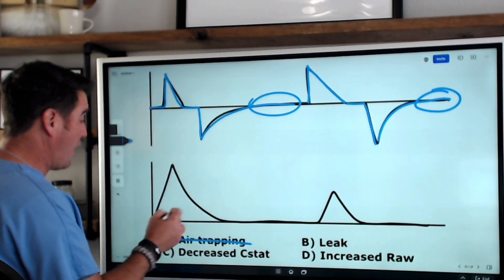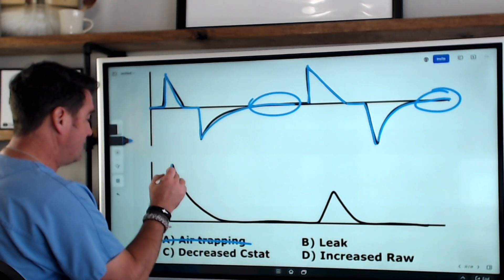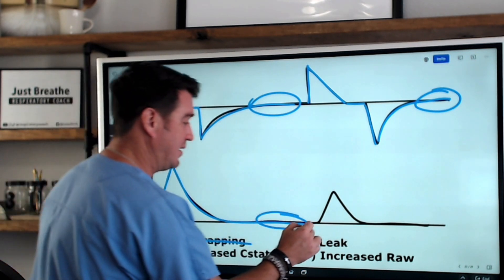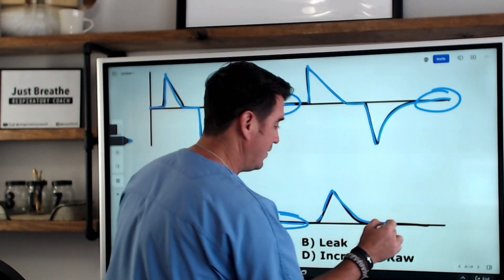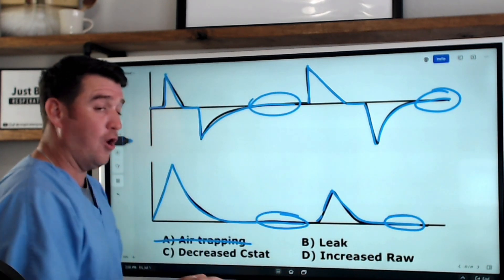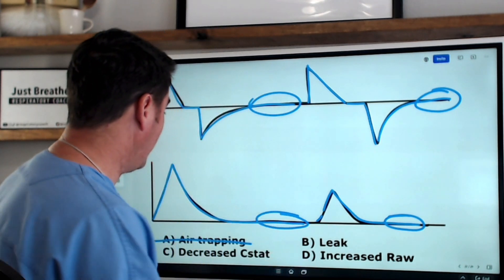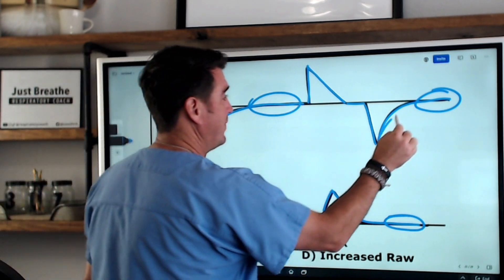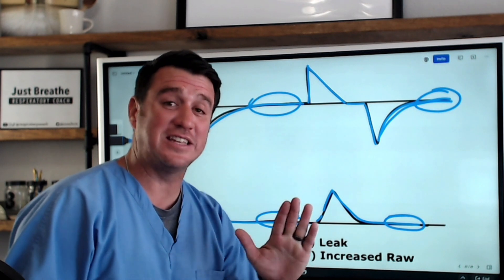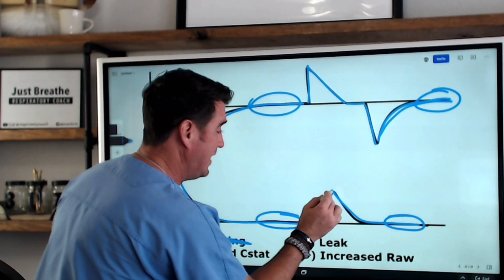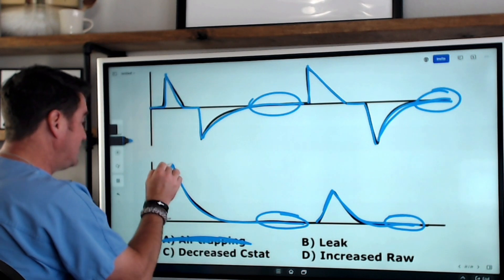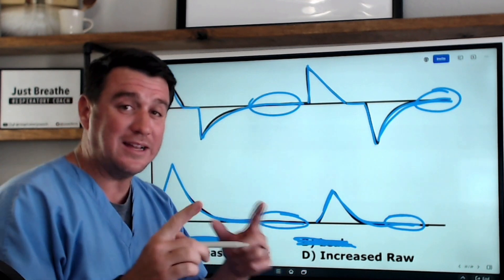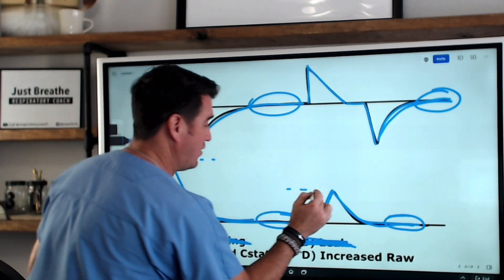So now we notice that our volume waveform comes up. And guess what? Back to baseline. Up, back to baseline. So this is interesting. We don't have air trapping because our flow returns to baseline. We also don't have a leak because everything we're putting in, we're getting back. Everything that goes in, comes back. So it's not a leak. So why do we have varying tidal volumes?